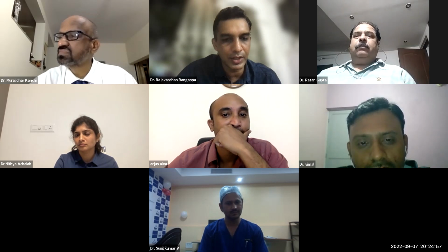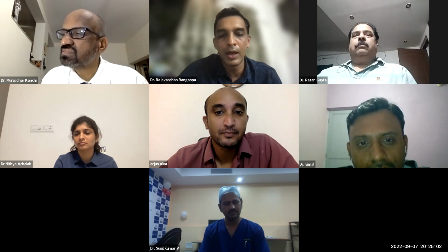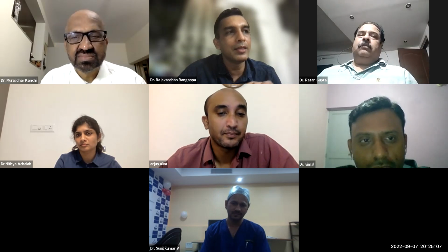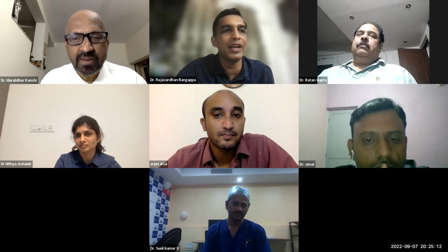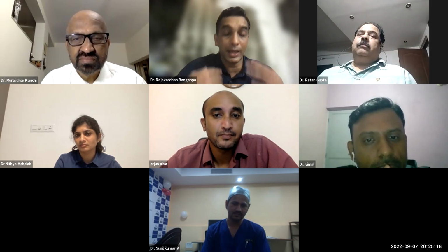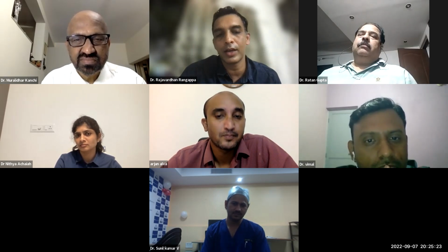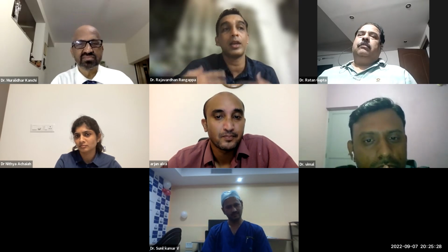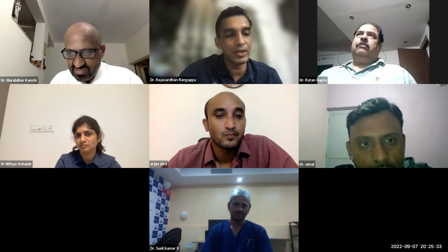We have done it for quite a number of patients. We might be able to establish our own case report series soon, but we are doing it quite regularly nowadays. But we should be ready. There's a possibility that some of them might develop increased work of breathing after extubation, so maybe support them with HFNC or NIV intermittently. Just imagine a tracheostomy patient on VV ECMO able to communicate, able to alert, and sometimes even able to feed on VV ECMO. It's a big achievement. Extubating them is going to make a lot of difference. Being able to speak makes a lot of difference in their care and management also. So some of the patients we are able to do it.